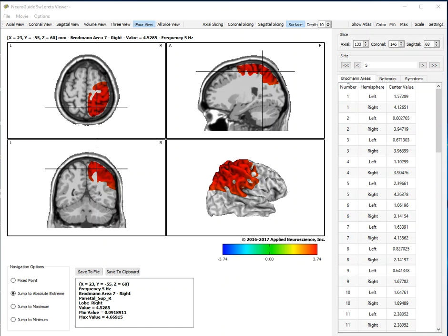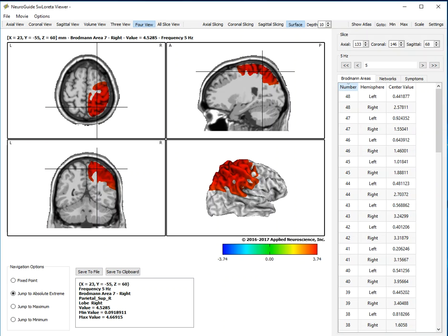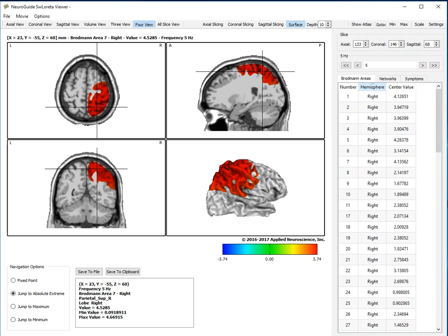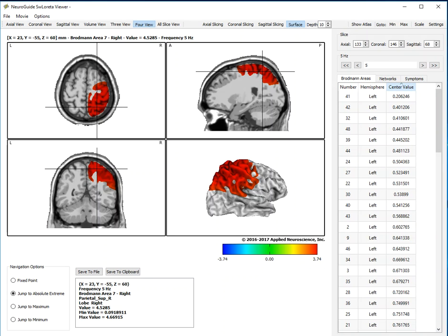For example, here are the Brodman areas. You can sort by number, you can sort by hemisphere, you can sort by the magnitude of the z-score and the center value voxel.